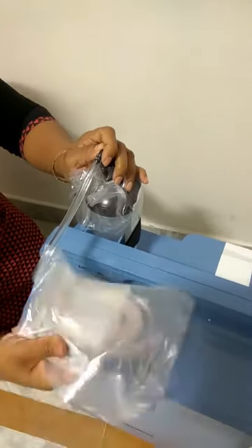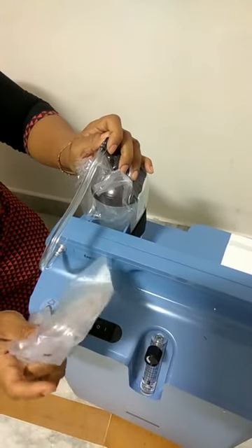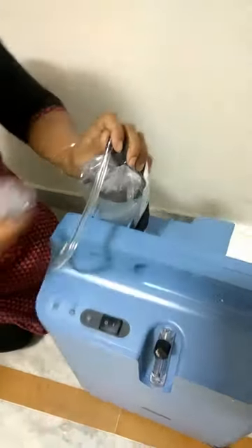This is the oxygen cannula. One end will go to the patient's nose, and the other end you need to connect with the humidifier bottle.